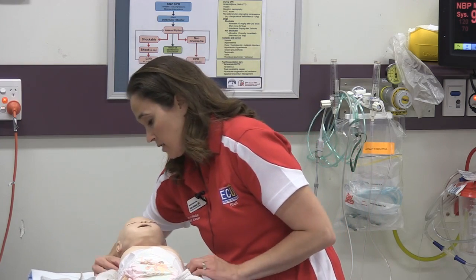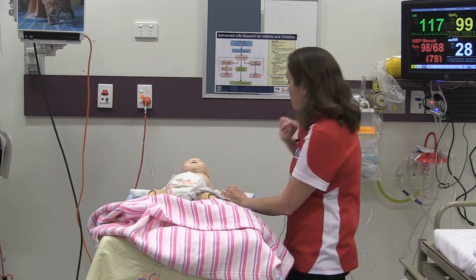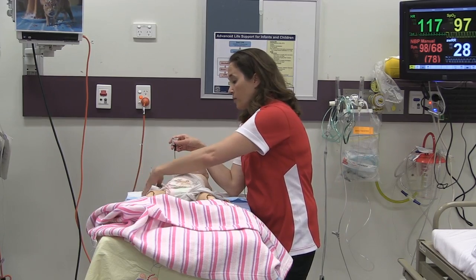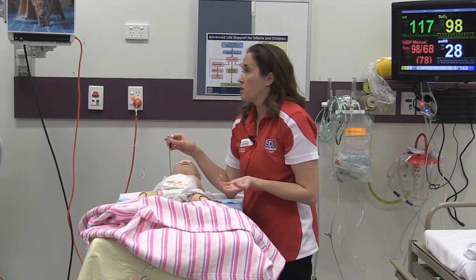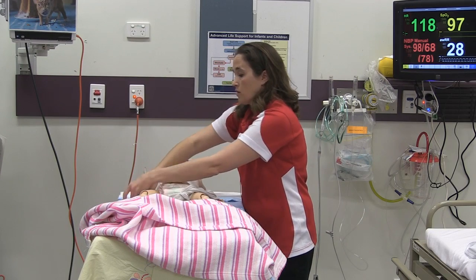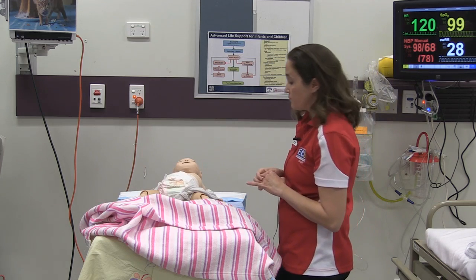It also has some areas here to put on the ECG monitors, and that'll allow the baby to come up on the monitor. And that's another good point. When you're doing simulation, you want the participants to act as if it's a normal patient as much as possible. So you want them to put on the saturation monitor so that they actually get a trace. You want them physically to do an intervention so that they actually get the information on the screen.